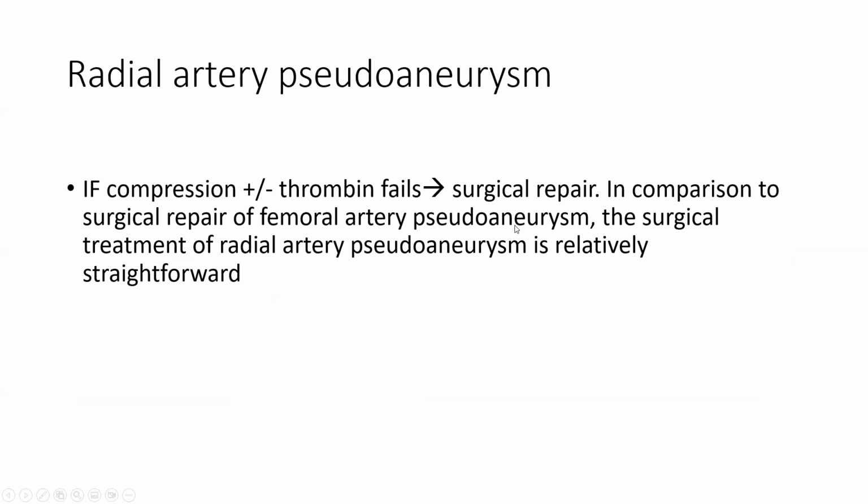And again, unlike femoral pseudoaneurysm, surgical repair of radial artery pseudoaneurysm is an easy procedure because it's a shallow superficial surface. So it's relatively straightforward, and you can keep a low threshold to doing that if it doesn't heal with TR band.